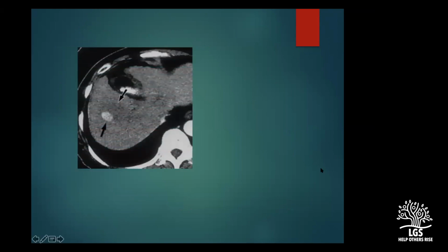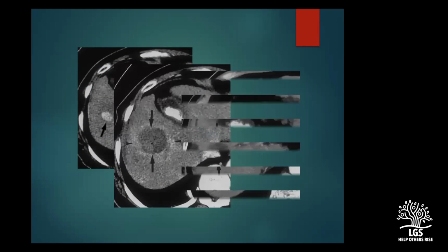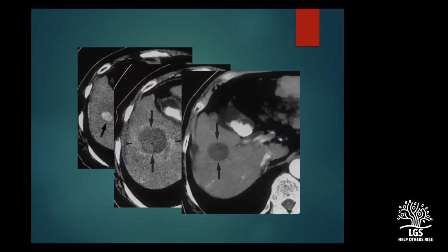So that is RFA, and I don't have to go into the details of the RFA, but it's a beautiful technique for people who have got solitary lesions. In fact, up to 3 or 4 tumors we can actually treat with RFA. At our institute we have microwave generators. So microwave ablation is done for tumors which are above 5 centimeters. RFA has got a limitation because we cannot treat tumors which are more than 5 centimeters with radiofrequency ablation.